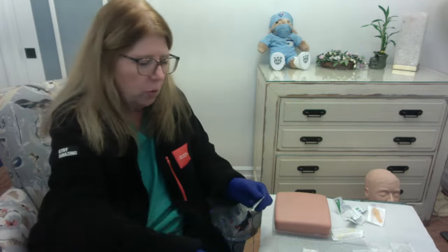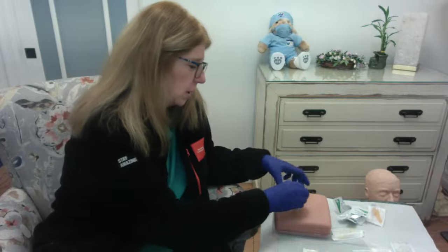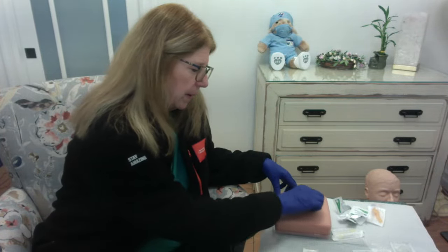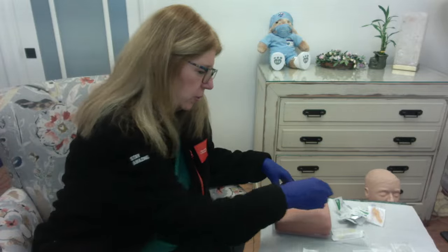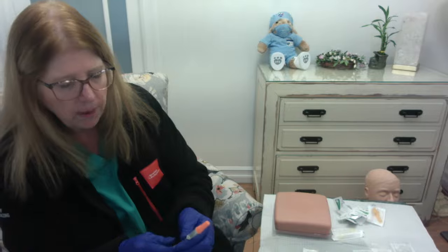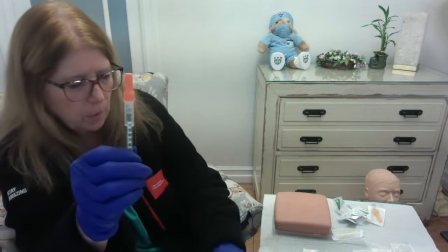I'm going to cleanse my skin. I'm giving this on the back of the arm. I'm going to cleanse my skin, put the alcohol down, start making small circles, bigger, bigger, bigger, nice concentric circles. I'm going to let that air dry. I have my insulin prepared from before, that 20 units of insulin, okay?